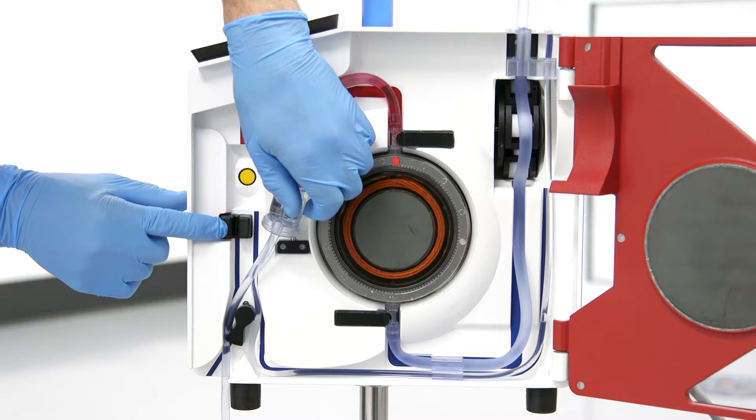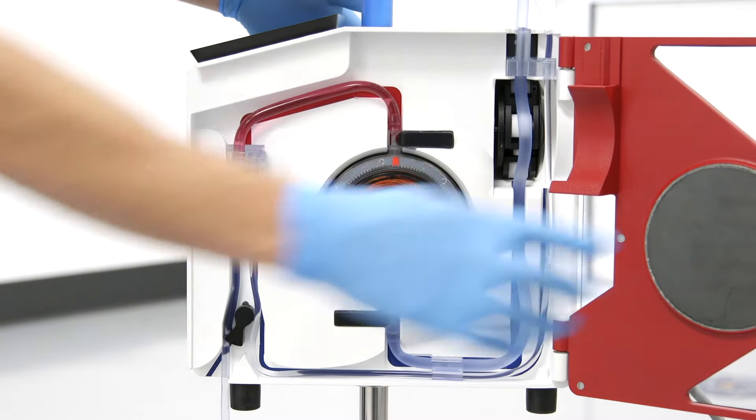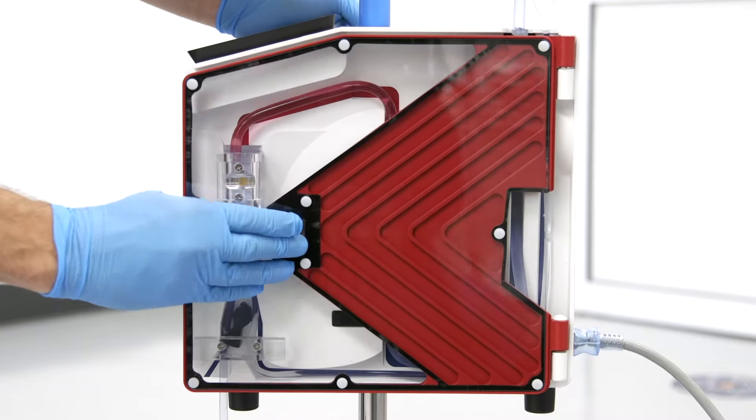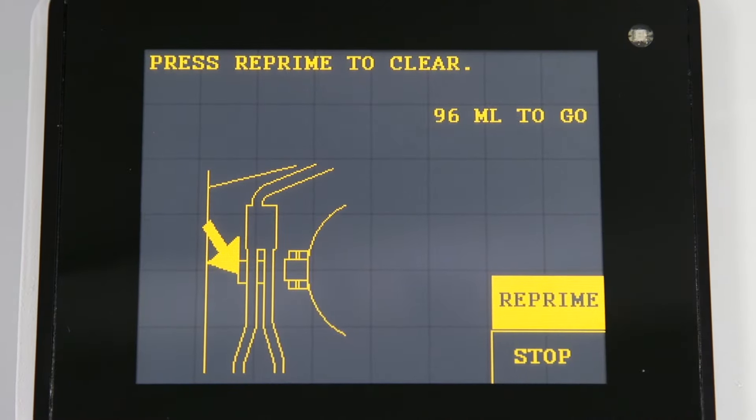Check the air detector and make sure that it is clean and the infuse line is properly seated inside the air detector. Finally, press reprime. The system will resume infusion when the repriming process is complete.